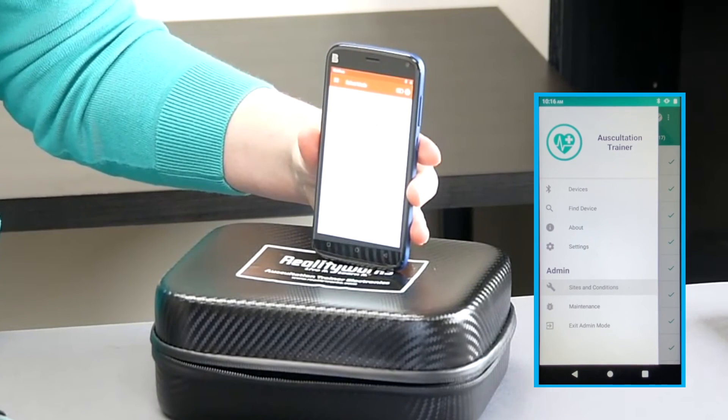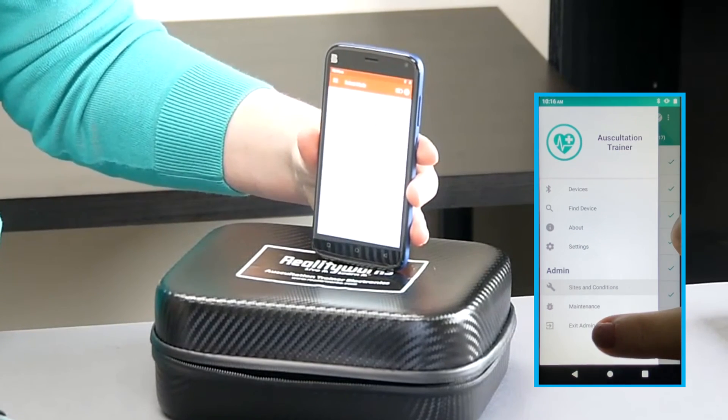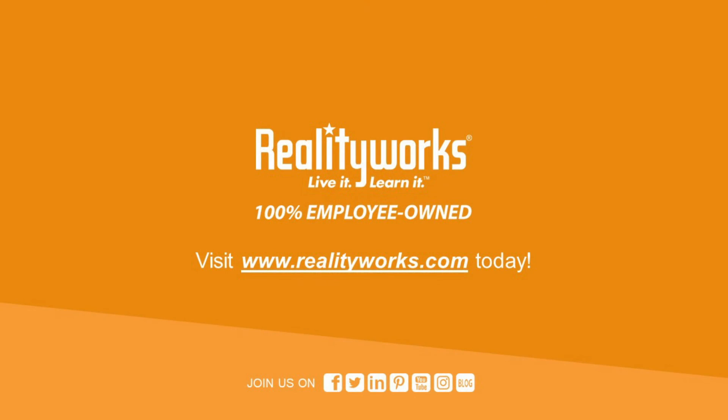Return to the admin menu and select 'Exit Admin Mode' to return to the student view. The included curriculum is composed of teacher presentation slides, student activities, and pre- and post-assessments — all totaled, it comes to one to two teaching hours of material. This concludes our demonstration of the RealityWorks Auscultation Trainer. If you have any questions or would like to receive more information, please use the information on the screen to contact us here at RealityWorks. We are happy to help you.